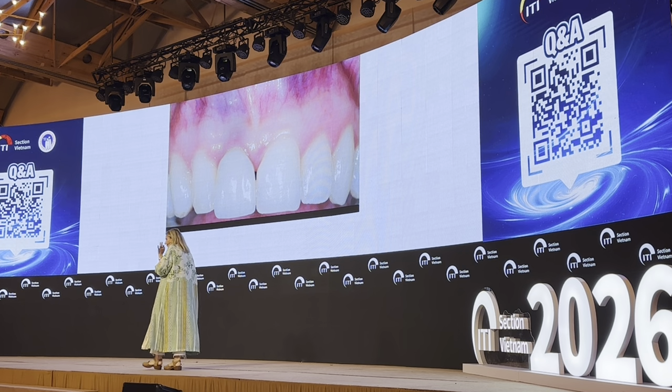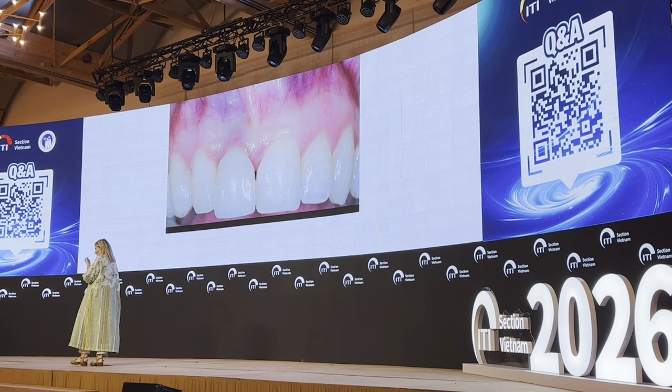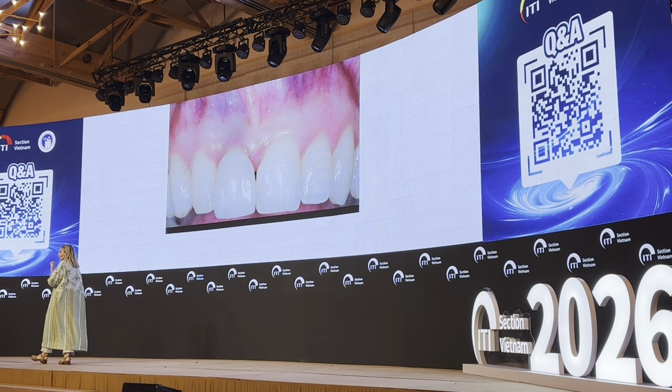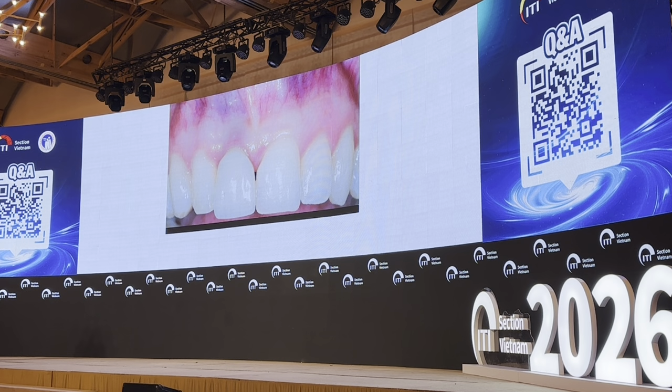But when you have a small defect and the patient is complaining about the small defect, you have to end up with a perfect result. Even a small mistake is capable of creating something which is even worse than the baseline situation. So small surgeries sometimes are not easier than bigger ones.